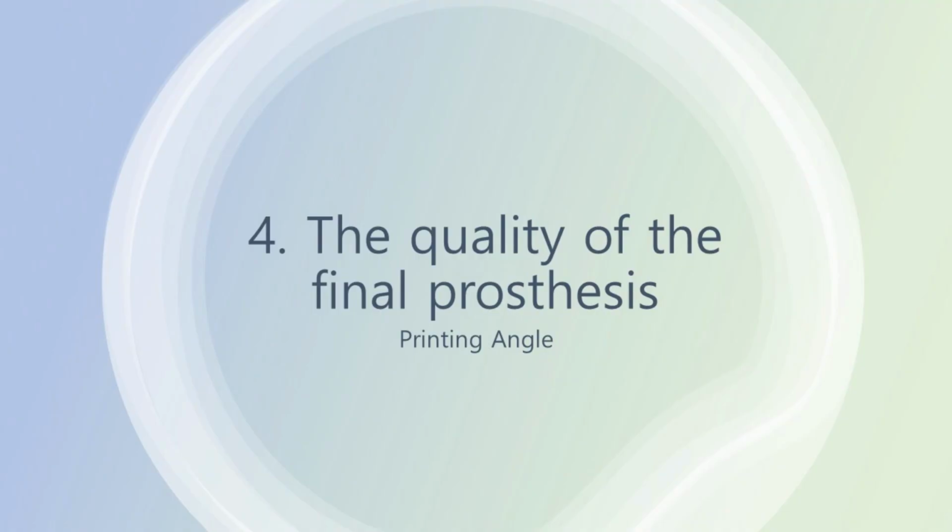adjustments in this area. In this section, we will discuss considerations beyond profile modifications that can address issues, especially in complex areas like the occlusal surface, which may not be resolved through profile adjustments alone. While profile settings in 3D printing are important, they are not a panacea for all problems. Particularly for objects with complex geometries or intricate details, additional strategies are required. One of the key methods to address these issues is by adjusting the printing angle.